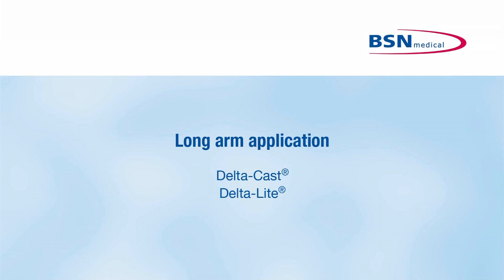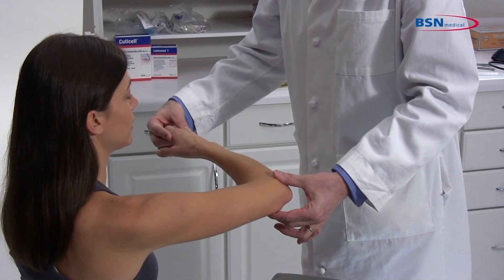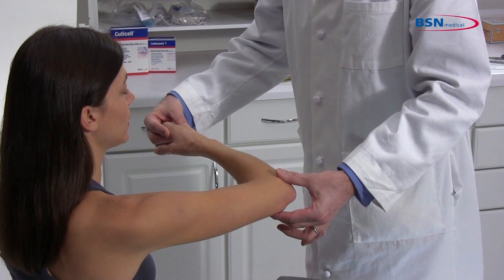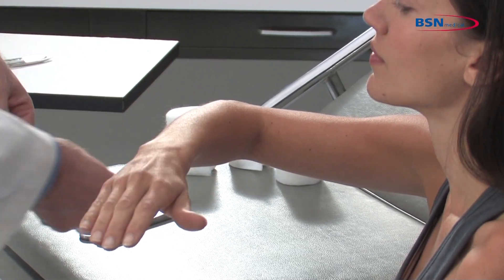Long arm application. For indications where immobilization of the wrist joint and elbow are required, follow physician's instructions on the proper positioning of the limb. A common position is with the elbow flexed to 90 degrees, wrist in slight dorsal flexion, and neutral with regards to ulnar and radial deviation.